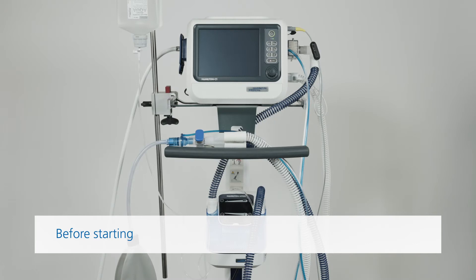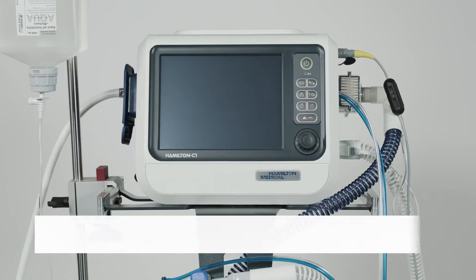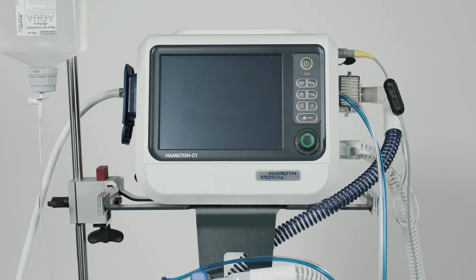Before starting the pre-op checks, make sure that the ventilator is connected to both primary power and an oxygen supply, that you are using the correct flow sensor for the patient, and that the breathing circuit is assembled correctly. Press the power standby key to turn on the ventilator. The ventilator will automatically run a self-test.